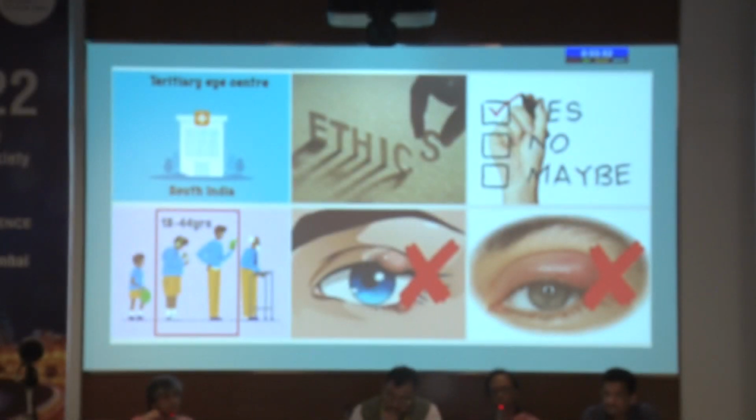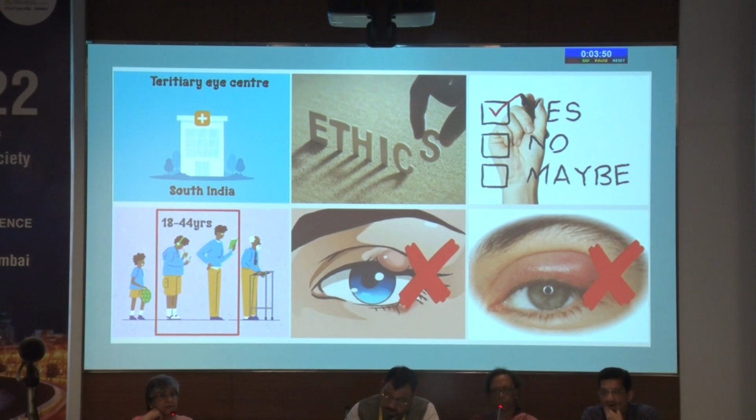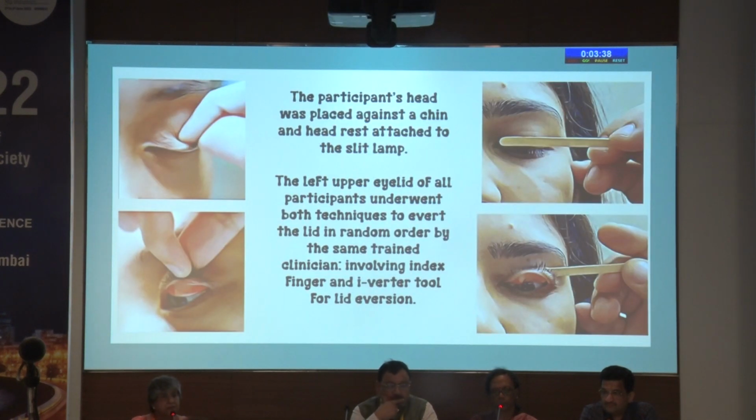Materials and methods: it was carried out in a tertiary eye care center. Ethics committee approval was taken. A written informed consent was taken. We took patients from age 18 to 44 years, and lid pathologies and lid swellings were not included in the study. The participant's head was placed against the chin and headrest attached to the slit lamp.